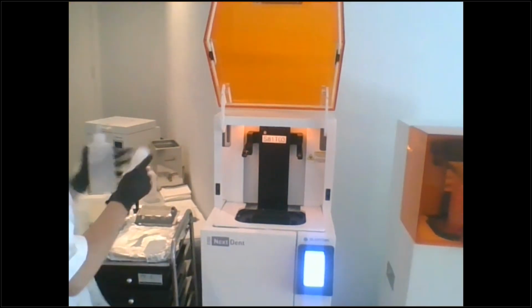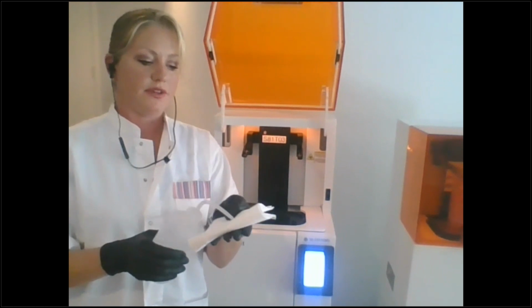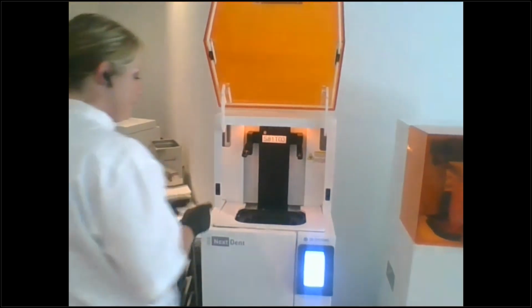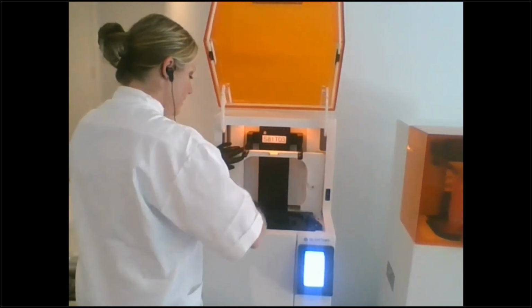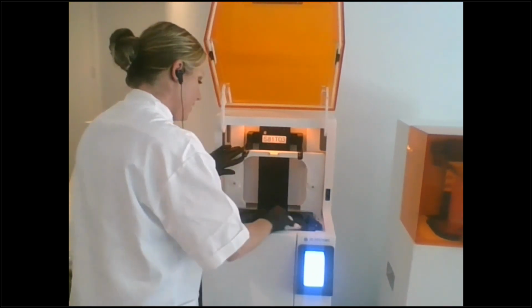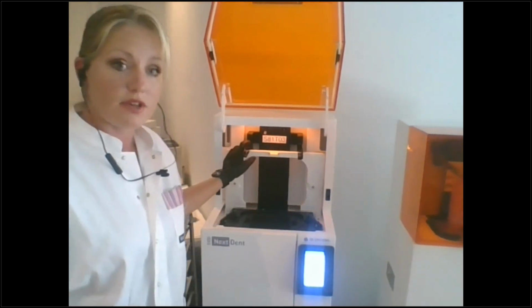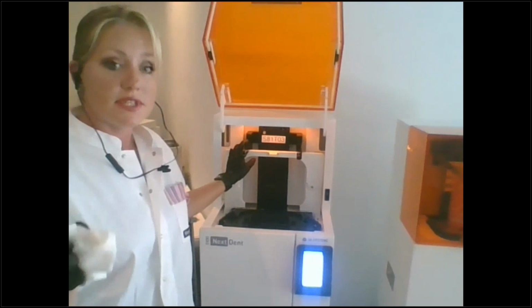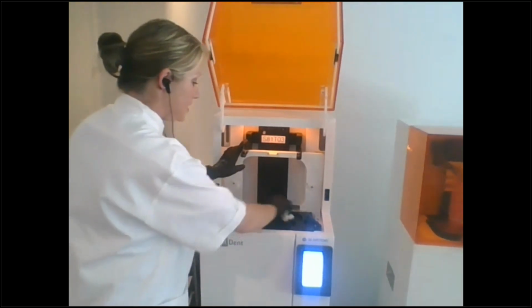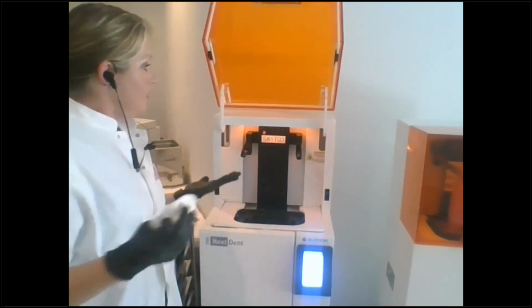So I use this little spray bottle of alcohol, and I put a little bit of it on a white ball, and then I clean up this lip around. And by the way, if something happened and you dropped something on it, like your resin or your build platform, and you caused a chip in it or something like that, it's not ruined. Give us a call. We'll give you instructions on what type of sandpaper to use to get that nice and smooth again.